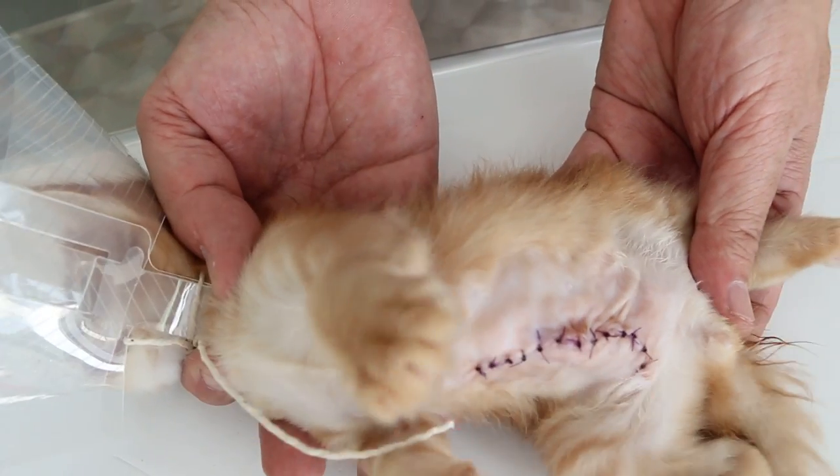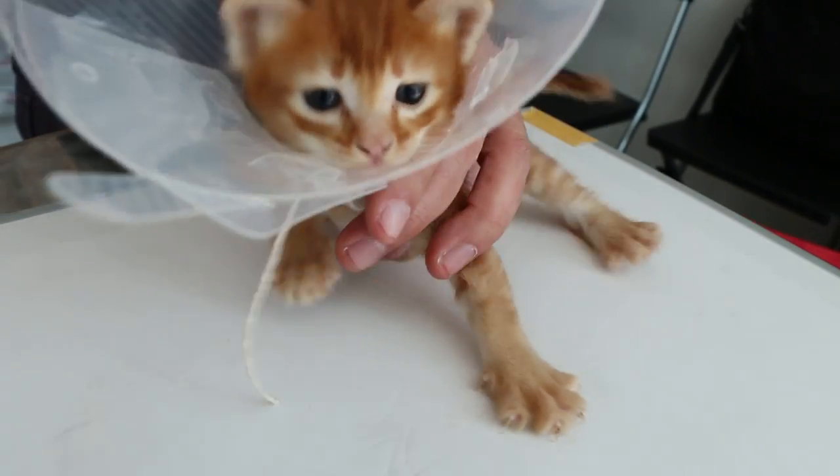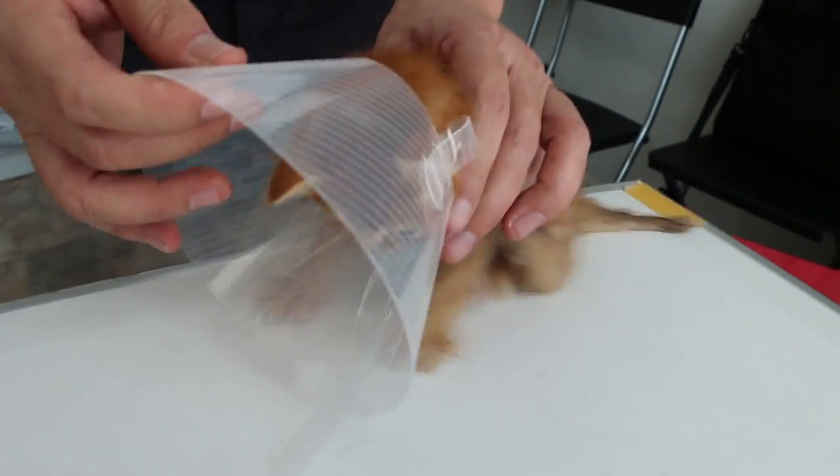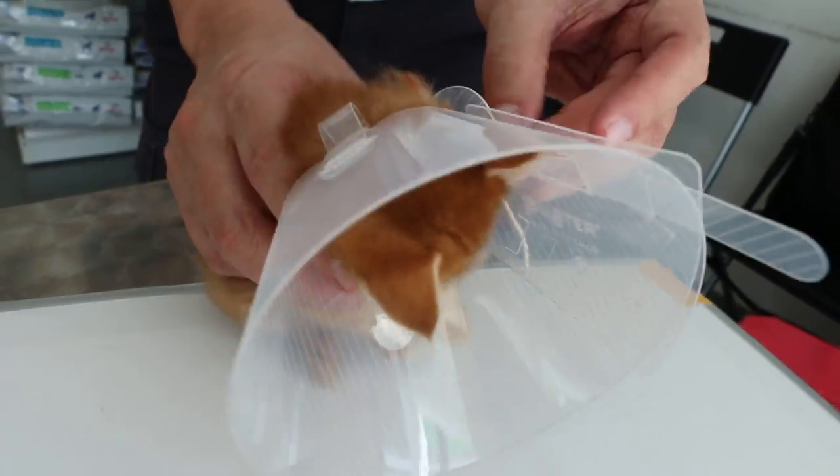What I will do is bandage it up — put a plaster there. It's not practical to use an e-collar because kittens can't eat. So I will take out the e-collar first.